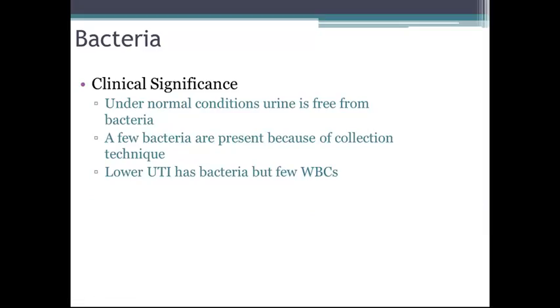Bacteria, clinical significance. Under normal conditions, urine is free from bacteria, and few bacteria might be present due to the collection technique if there is a little bit of contamination.